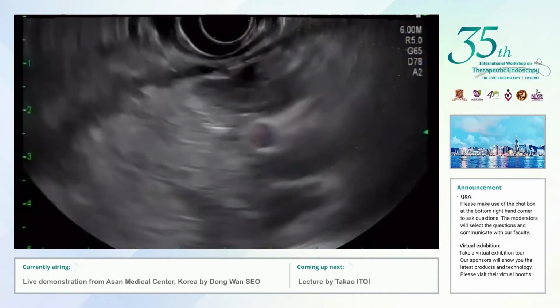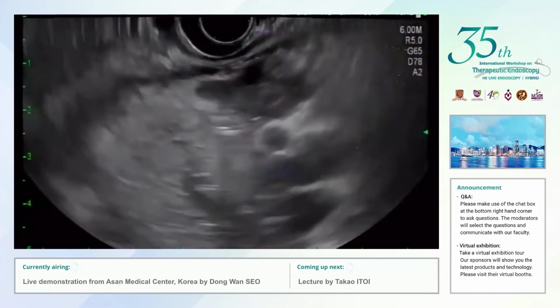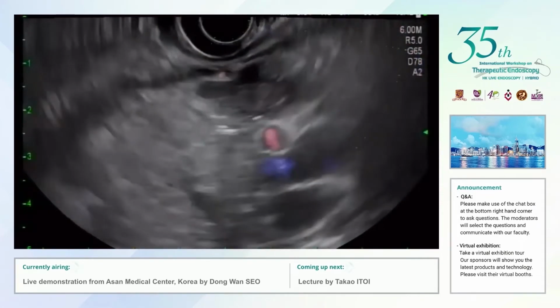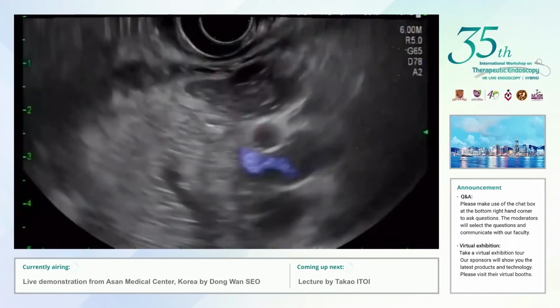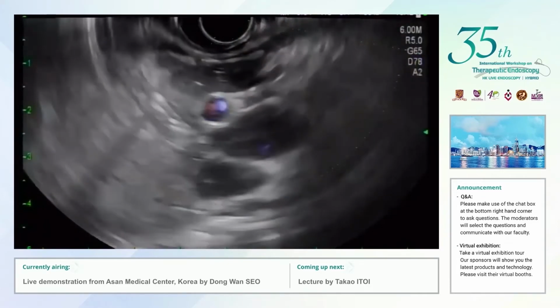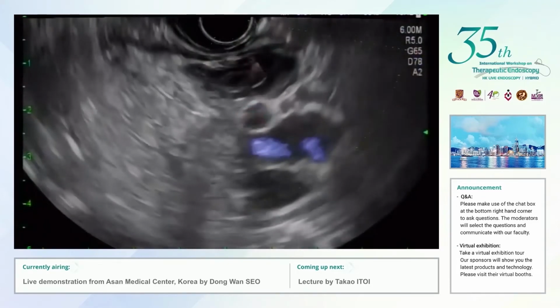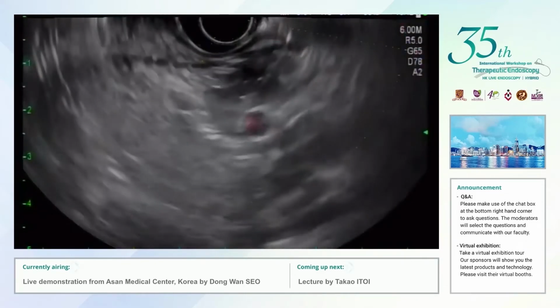And sometimes there can be some leakage of cystic fluid. So if the procedure time is long and difficult, there is some risk. But it is not severe. I don't think it is a very severe risk because we are dealing with mostly benign lesions, not malignant lesions.